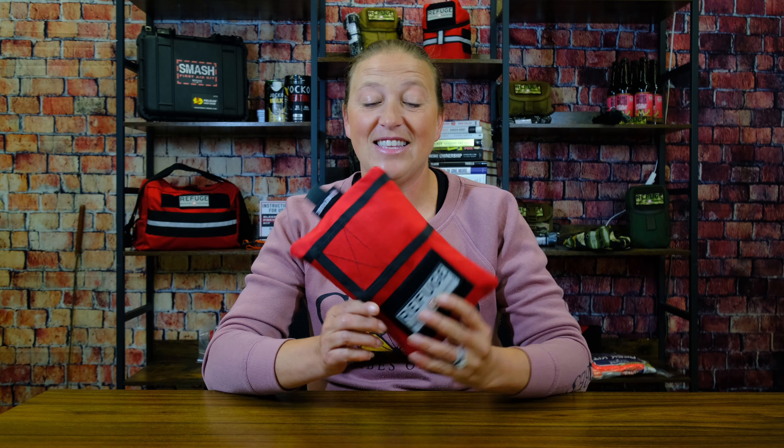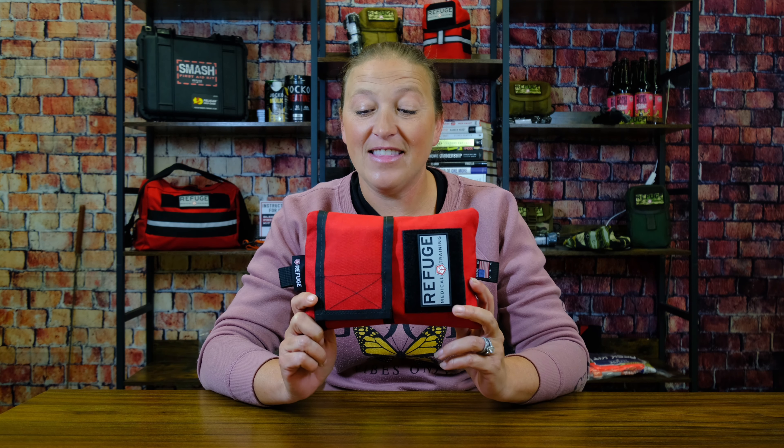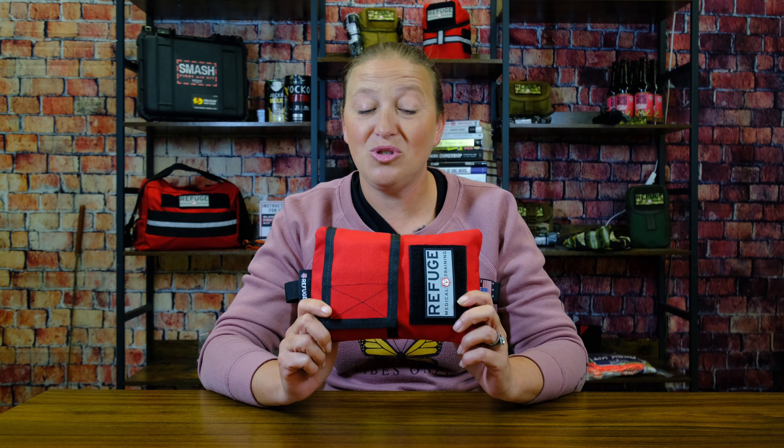One of the best gifts that you can get your significant other, the mother of your family, of your child, is the Boo-Boo Kit from Refuge Medical. We specifically designed this kit with mothers in mind. This has everything that you need to treat minor scrapes and boo-boos up to major bleeding, because you never know quite what your kids are going to get into.